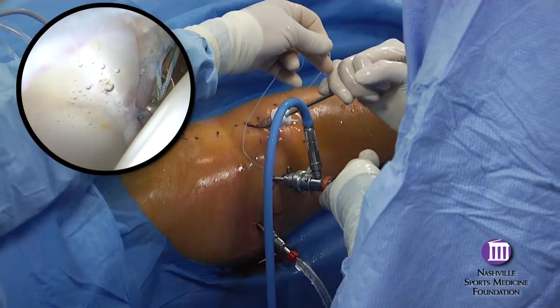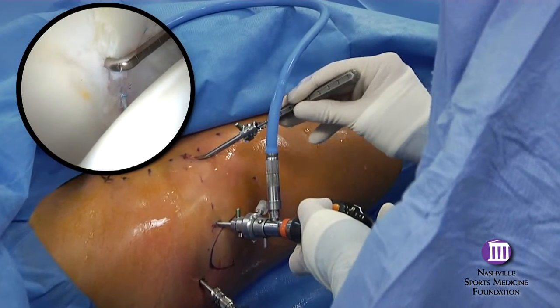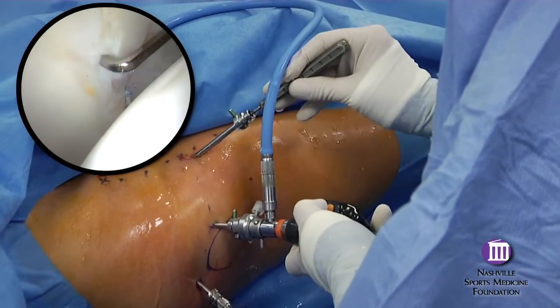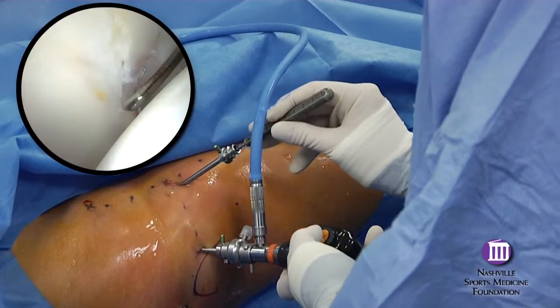The anterior portal is the most utilitarian for most central compartment needs, but the distally-based modification is essential for proper anchor positioning necessary to achieve an anatomic labral repair.